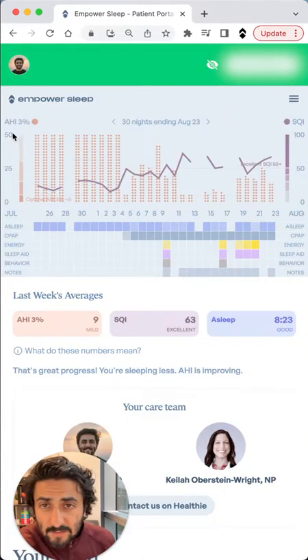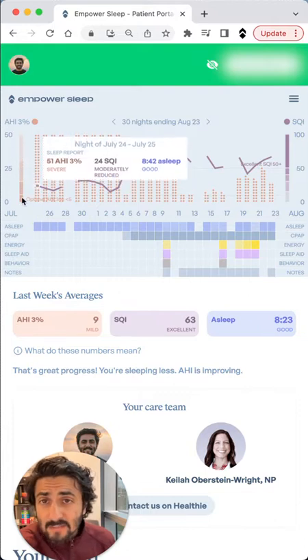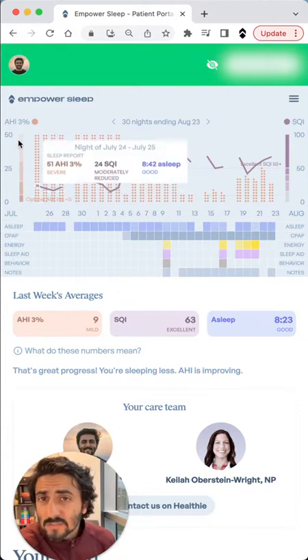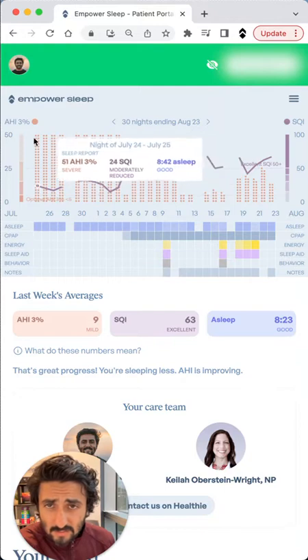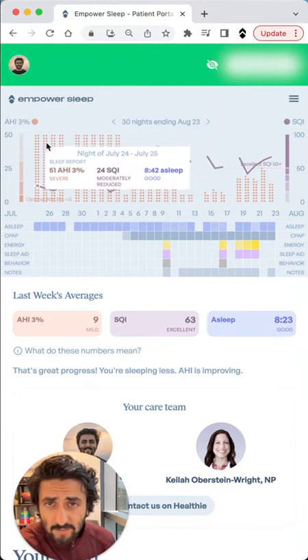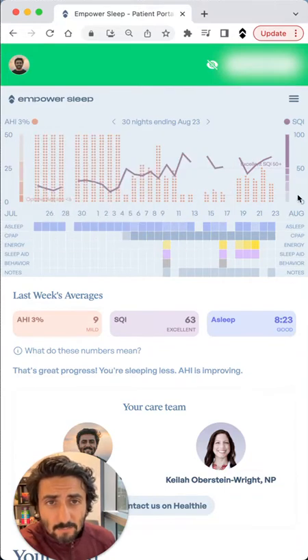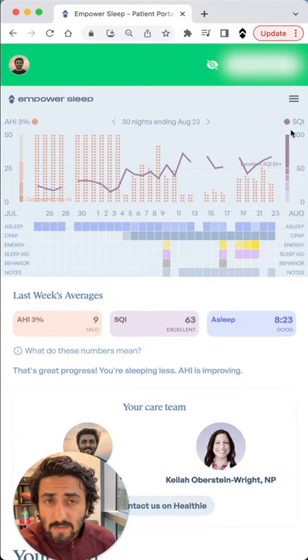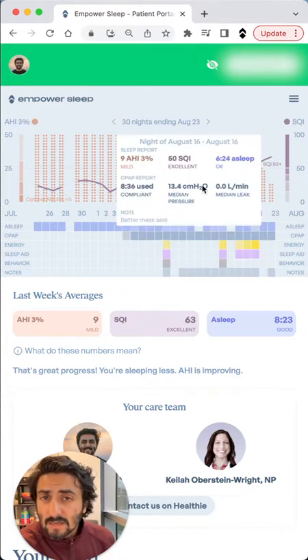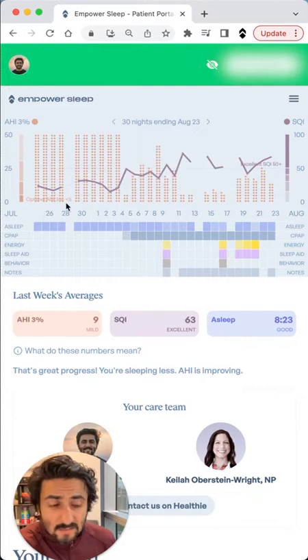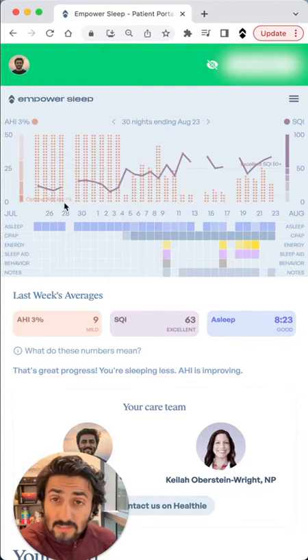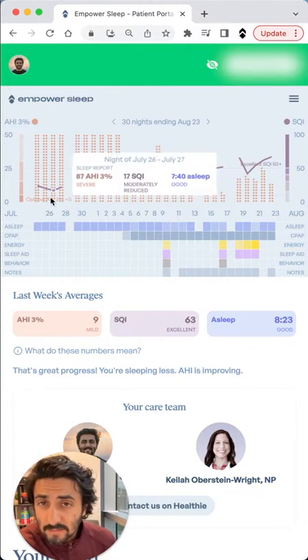On the left here, we have apnea indices — this means pauses in breathing per hour. This is the red bar graph. On the right here, we have sleep quality, which is a medically derived sleep quality index. This data is coming directly from a sleep testing device.